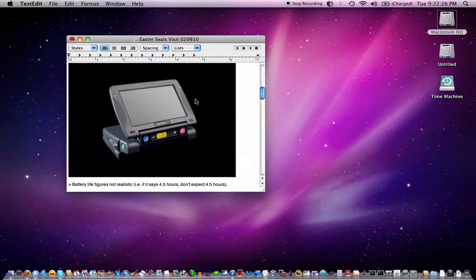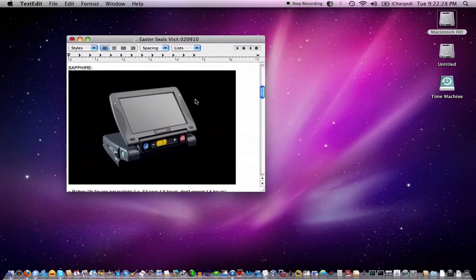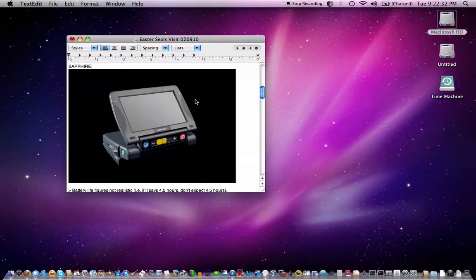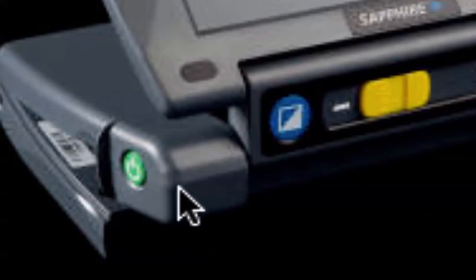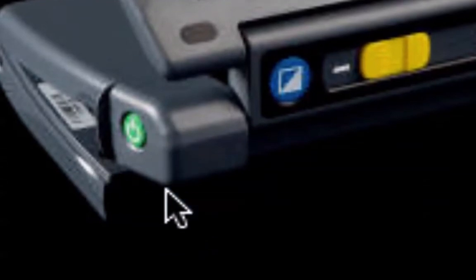Now, what do I mean by semi-portable? Semi-portable is a cross between a portable unit and a desktop unit. On a desktop unit, you have a tray with a screen on top, or beside it in some cases. JLS1114 has a video on hers, so that's an example of a desktop unit. This is a semi-portable unit. It's a 7-inch screen that can fold up and around, and this little area here is propped up because it has a writing facility aboard.